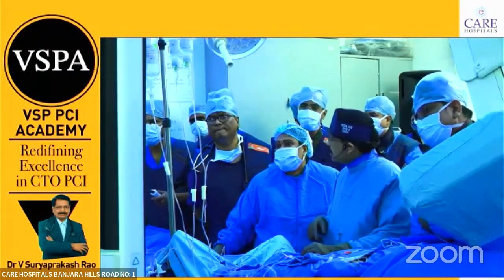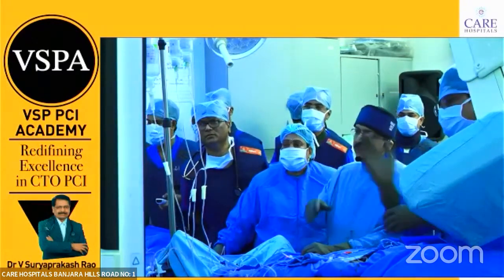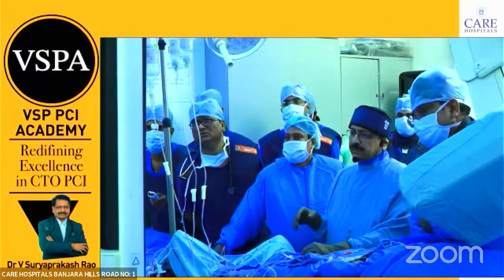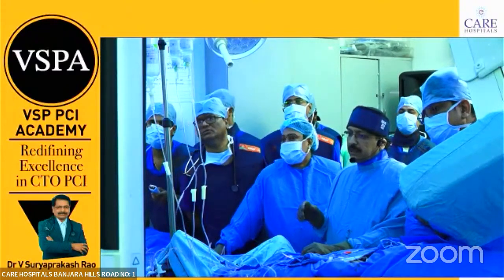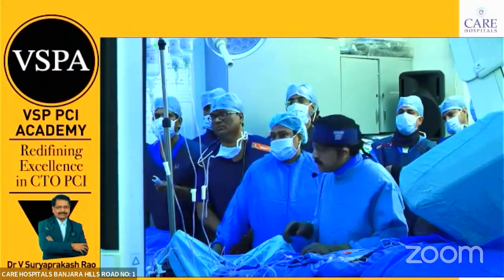Please bring it to the middle and freeze it. Freeze it, the distal cap and the wire. Is it a branch, some branch?